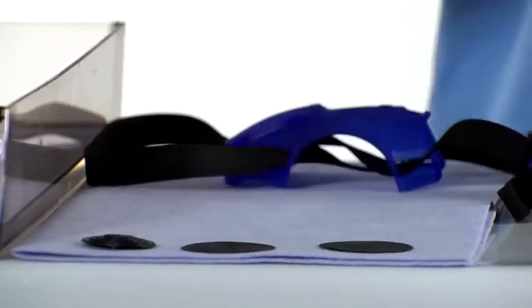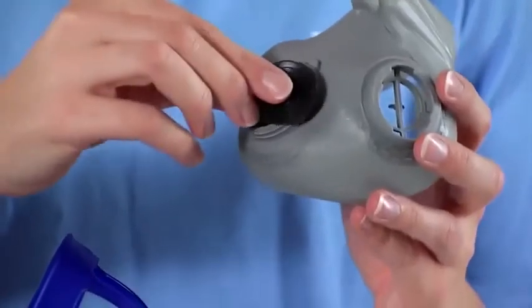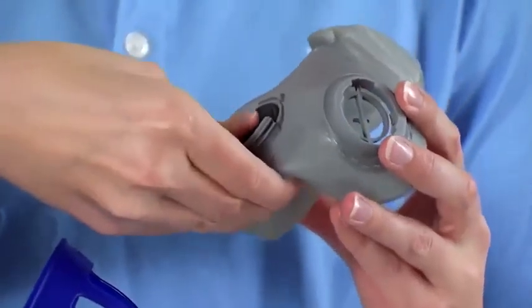After cleaning, press the valve disc into the valve seat, then reassemble the mask completely.